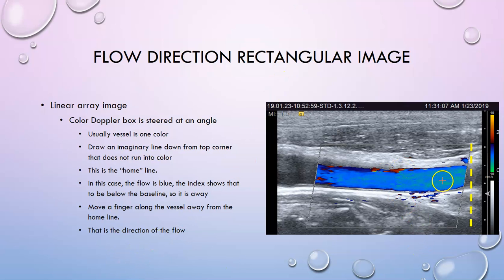So this is blue, so it must be moving away from that line. Therefore, it's moving from right to left.